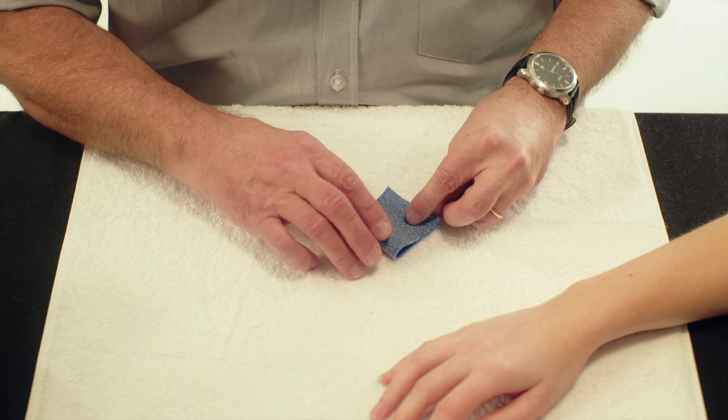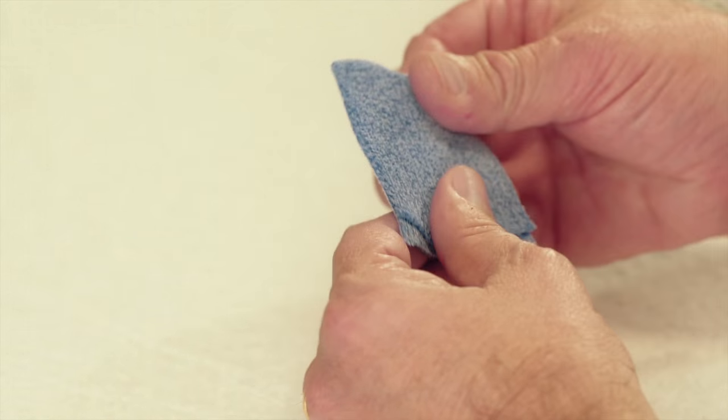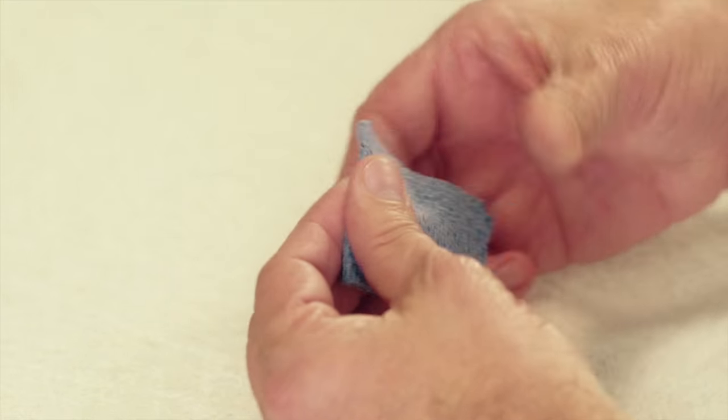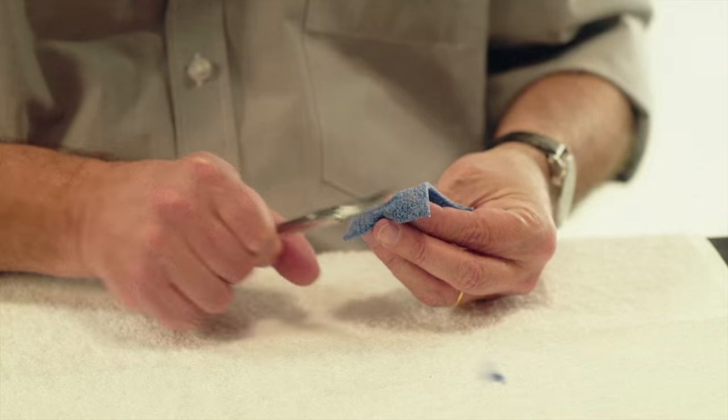Heat and fold the Orphicast double. Stretch it a little. Cut a hole for the thumb on the upper side of the material.